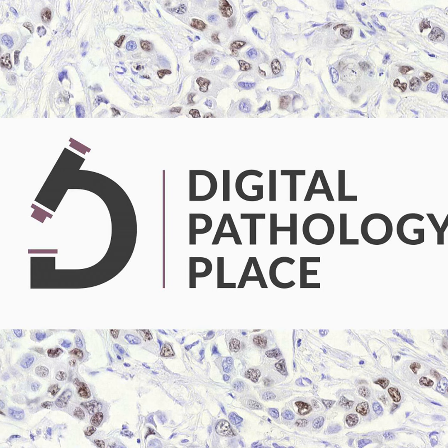So they had two biopsies, and the dates were from 2011 to 2020. And they had a lot of these biopsies, 4,744, and they were scanned and analyzed by an in-house AI cancer detection algorithm. So they developed their own. They didn't use any commercial tool.